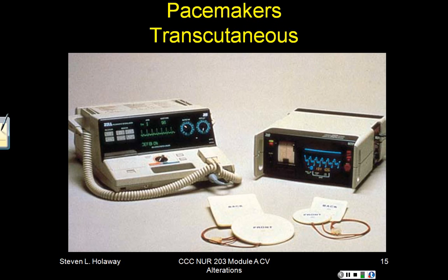Let's take a quick look at some transcutaneous pacing units. These are a couple of different types. The one on the left is a Zoll transcutaneous pacer, something that's been out for many years.